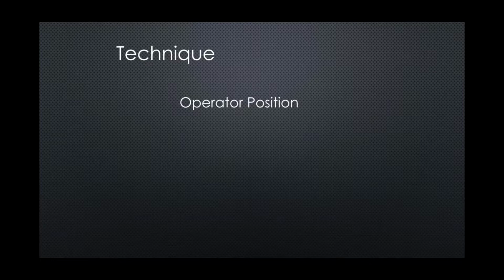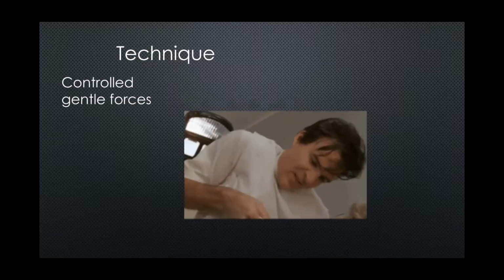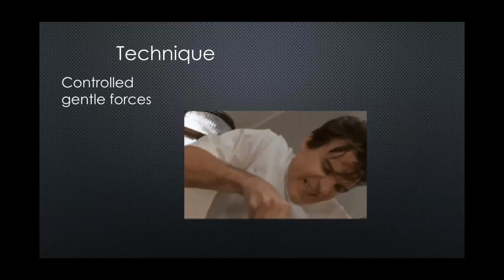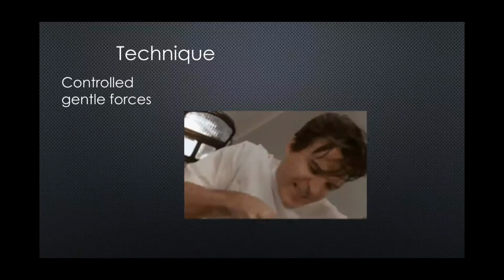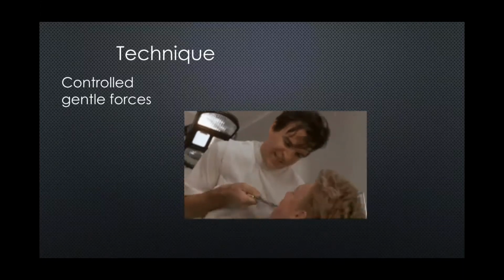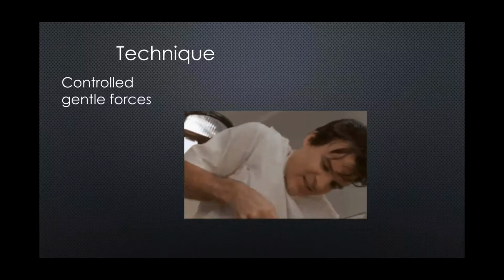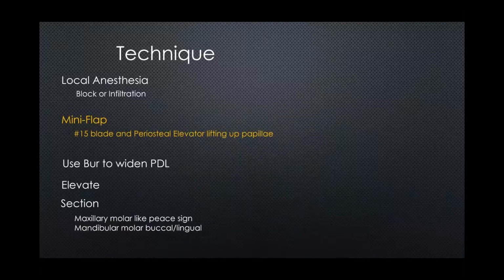Of course, you're a lefty, it's the opposite. Okay, and what we want to do is use controlled, gentle forces. That's the key to taking teeth out. It's not roughing it out, it's not pushing out. That's when teeth break off, that's when roots separate. Just controlled forces. That's when soft tissue injuries occur and patients get upset. Nice and easy.